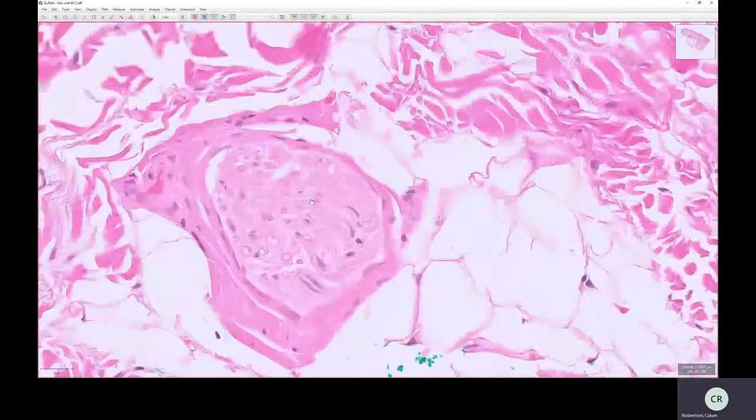So nerves all have this look. This is the nerve here, and we're just seeing a cross section of nerves, which you can see as these little circular areas. Here, here. These are eosin stained. So this is the cytoplasm of the cells, and what we're seeing here is an axon that we've cut through. So these are the axons of the neurons that we've cut through.